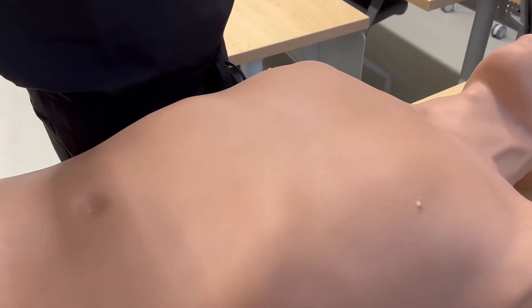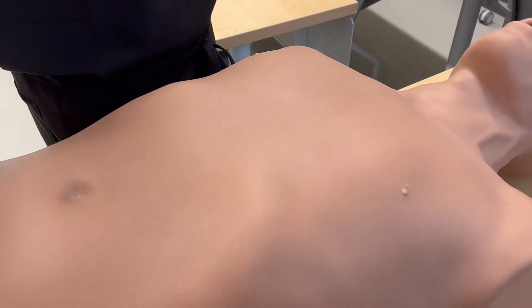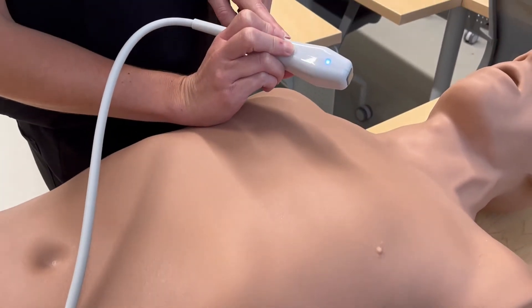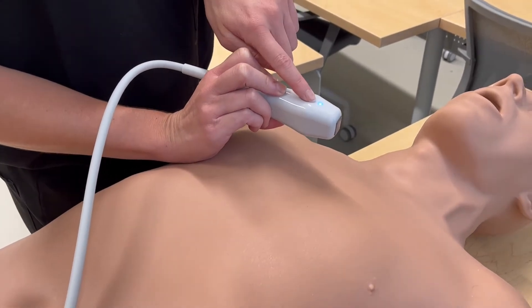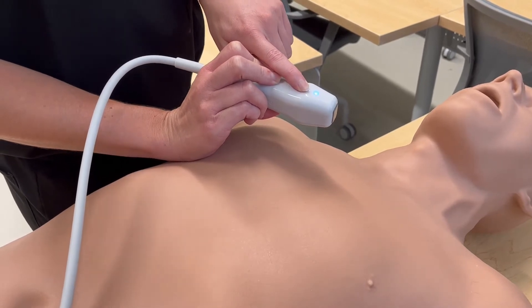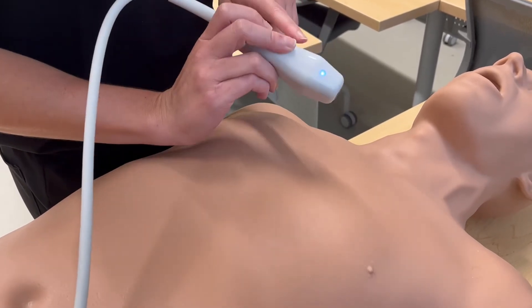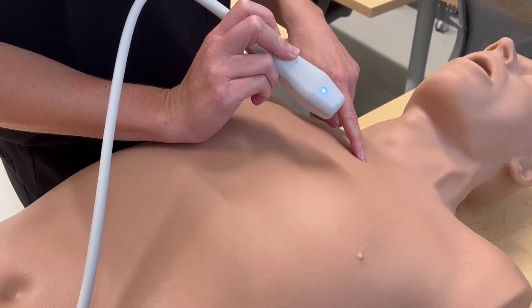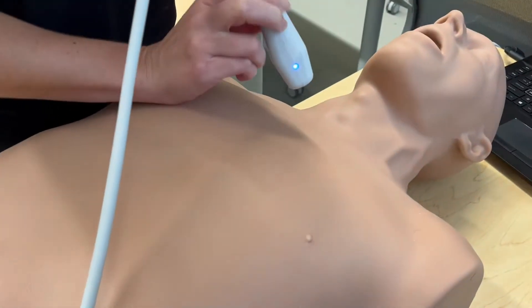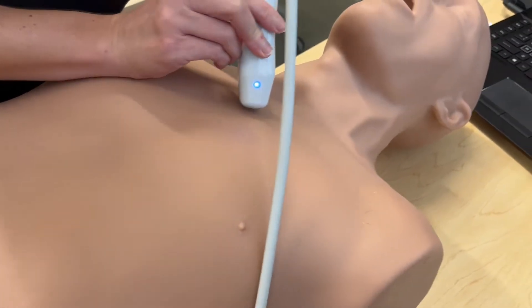The first view in our echo is the parasternal long axis view. In order to obtain it, we're going to be using this phased array probe. This light indicates the probe marker. We're going to put the probe to the left side of the patient's sternum with the probe marker pointing towards the left hip, starting at about the third or fourth intercostal space.